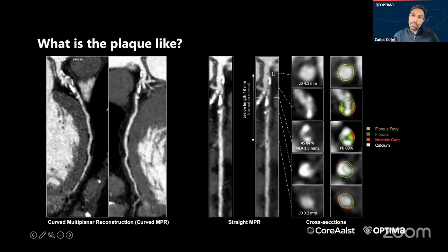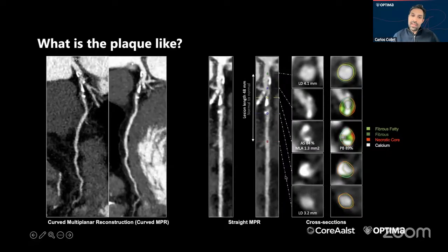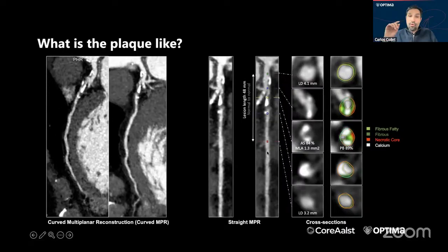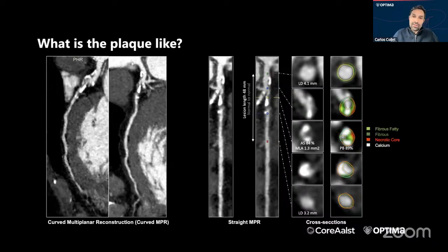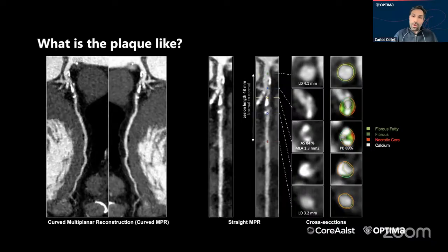We measure from, let's say, this mid portion of the left main, and then we go until the mid LAD. That appears to be very, very normal, and this gives us a length of 48 millimeters, which is perfect because we have a stent of 48 millimeters. So theoretically, this could be covered completely from normal to normal with one stent.